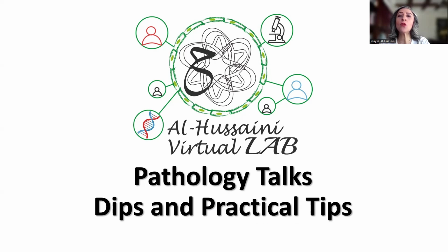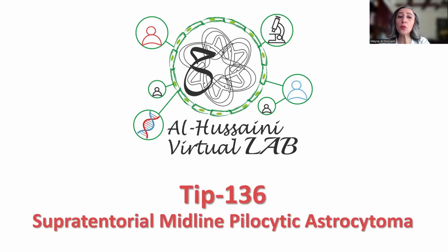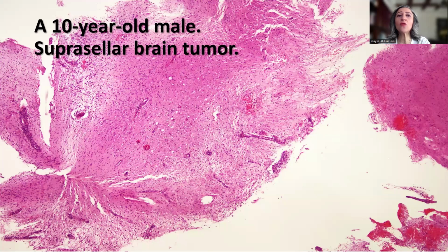What I'm going to be sharing with you today is a nice example of supratentorial midline pilocytic astrocytoma. This is a case of a 10-year-old male patient who was found to have a suprasellar brain tumor or brain mass. This is the low power magnification of the fragments that were submitted for examination from this tumor. As you can see here from the low power magnification, the tumor is kind of pink in color, which gives you a hint that this is probably an astrocytic tumor.